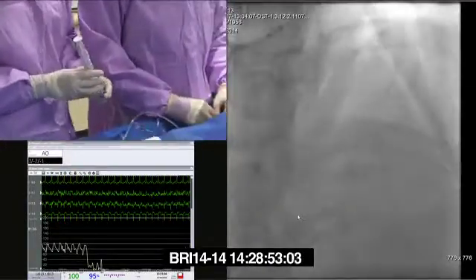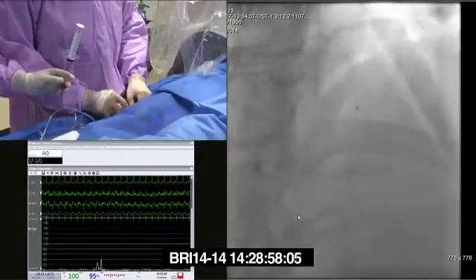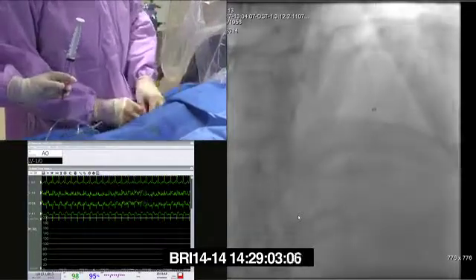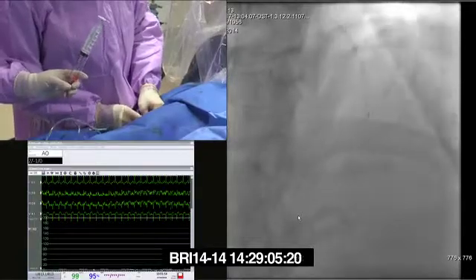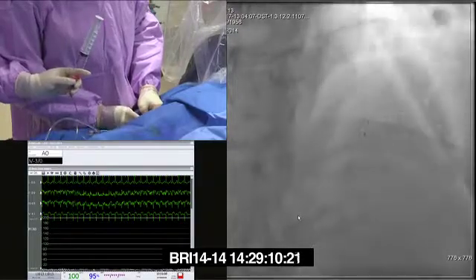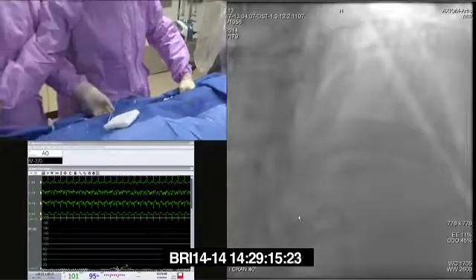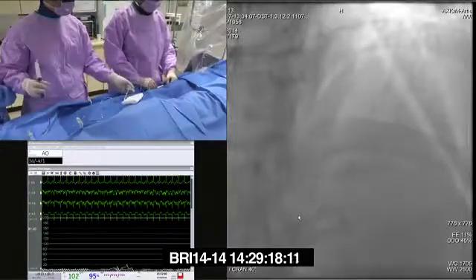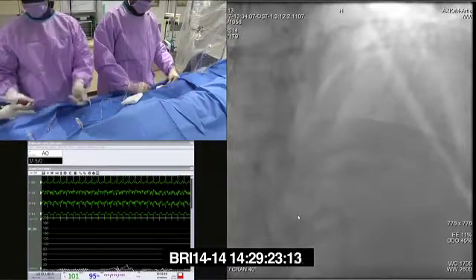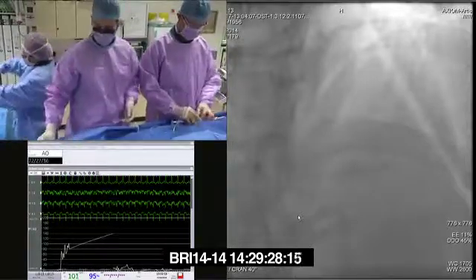So let's just go negative again. Negative. Thanks. And I guess that's the compromise with the slightly less supportive guide, is that we're not able to get quite as much push. There is no much flow. Yeah, we're right in on this. Okay, that's great. Thanks, Ian. And again, just bleeding out there, making sure there's no air in the system.